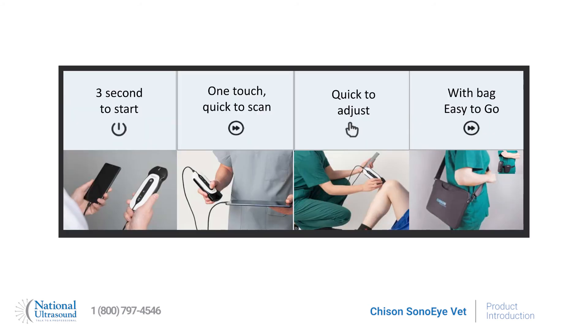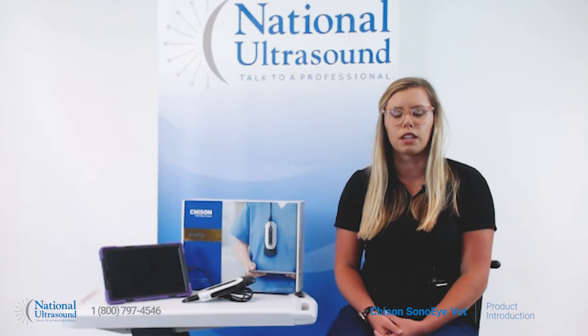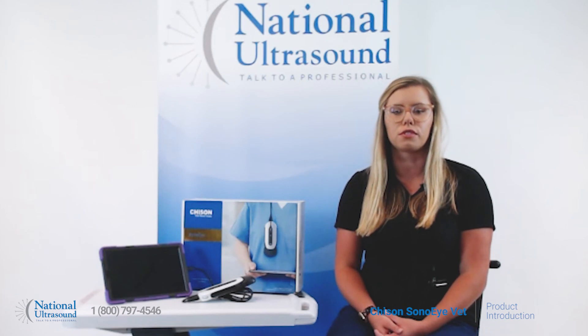The Chison Sono Eye Vet has superior image quality and penetration when comparing it to other popular handheld devices in the market. It includes a three-year warranty, carry case and a Sono Eye app user license. Schedule an online demo today with your National Ultrasound Sales Rep.